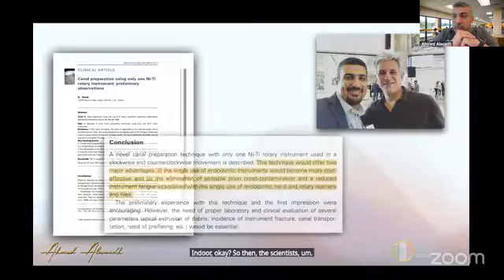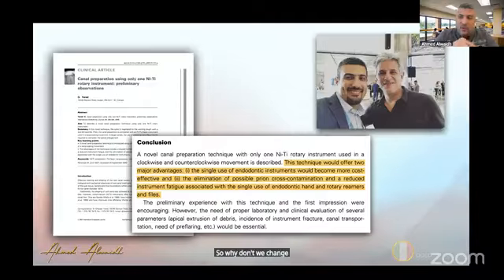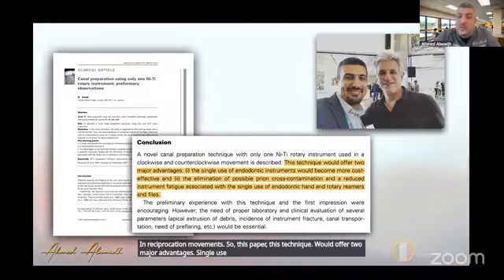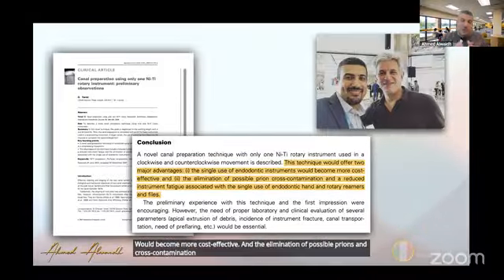Then the scientists thought that the problem, the reason we're getting file separation, is the movement. So why don't we change the movement? In 2008, Prof. Ghassan Yared introduced the concept of reciprocation, when he used the F2 file of ProTaper, which is size 25, in reciprocating movements. This technique would offer two major advantages: single use of endodontic instruments would become more cost effective, and the elimination of possible prions and cross-contamination, because you're using fewer files.